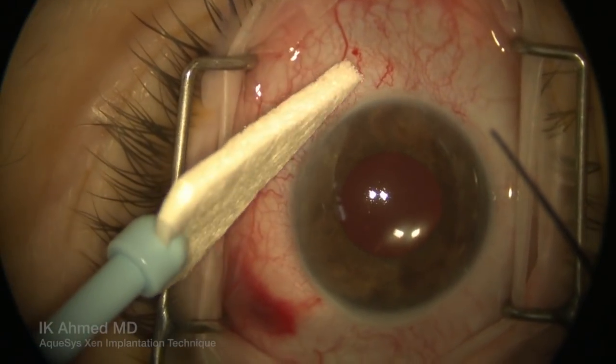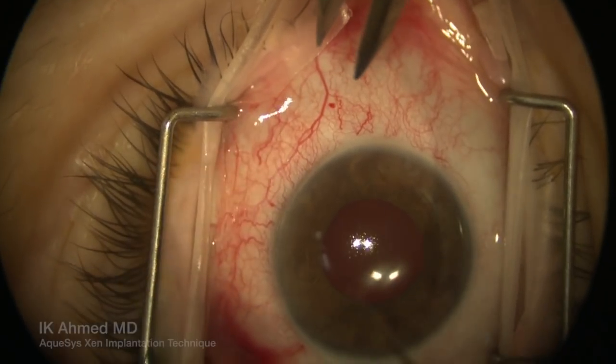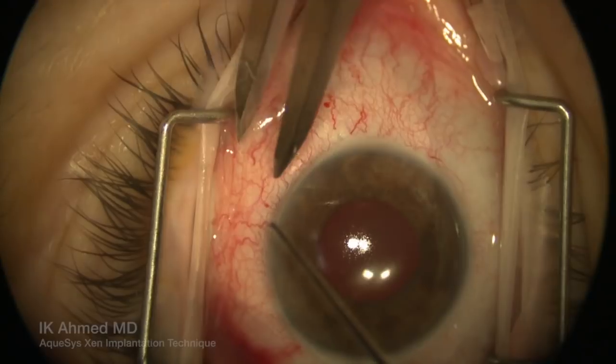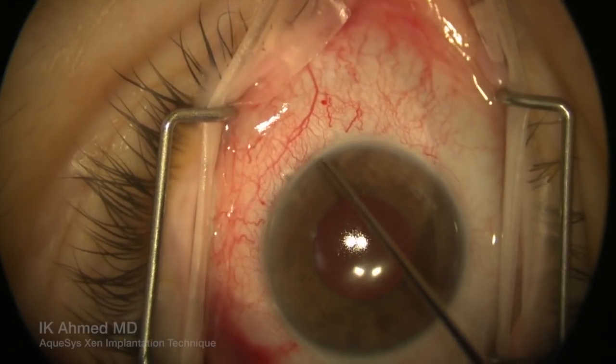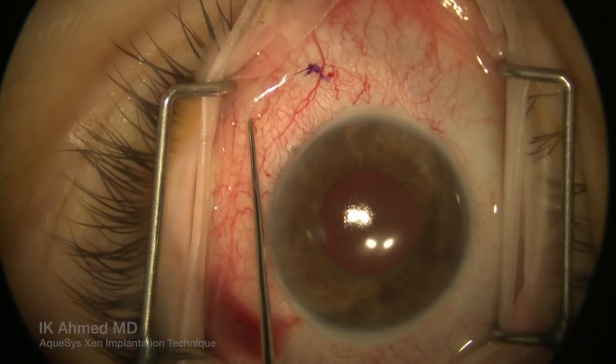This video demonstrates the XEN implantation by AqueSys. We are going to mark the limbus three millimeters posterior. This will be our planned exit site of the implant as it emerges through the sclera. And we put a couple of marks adjacent to where we wish the implant to emerge from.